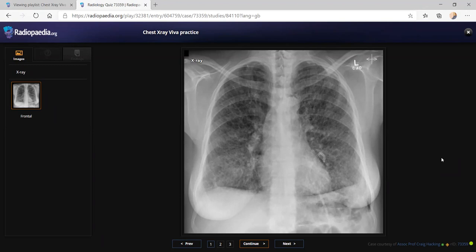First of all, I'm seeing a catheter overlying the cardiac shadow. I think she had a pleural tap, a pleural drainage tube in situ. The most obvious finding is prominent reticular shadows involving both lung fields, more obvious in the basal lungs. The volume of the lungs is preserved. The bilateral costophrenic angles are obliterated, suggestive of mild effusion, or it could even be due to pleural thickening.